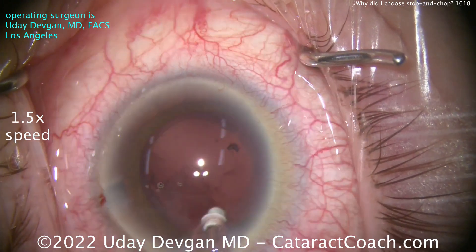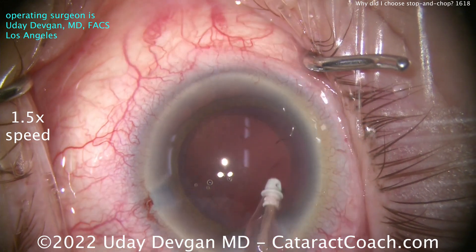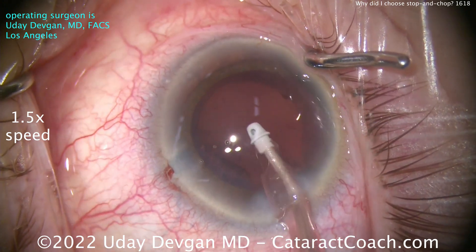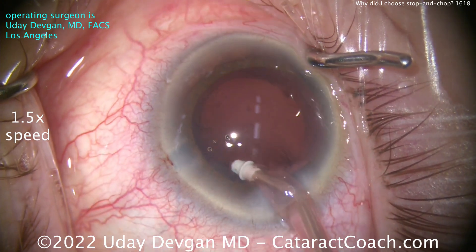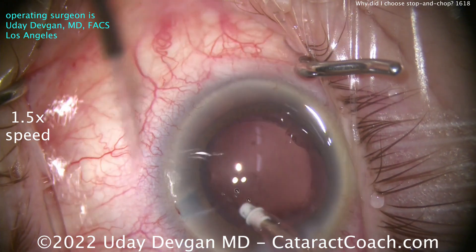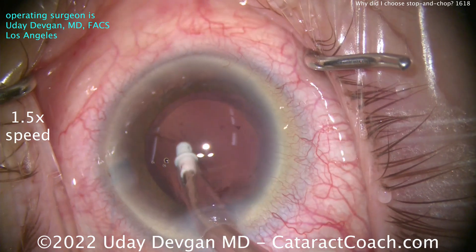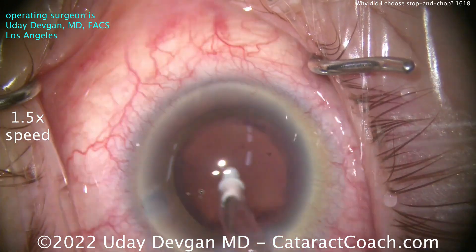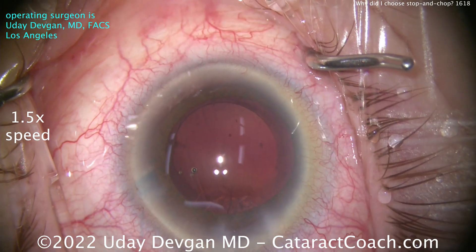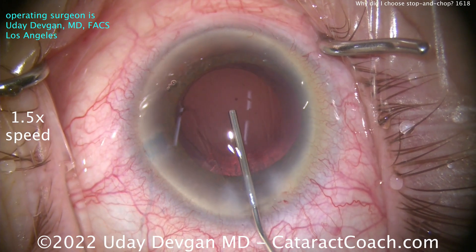I did it, and the patient had a very nice outcome. Now we're going to resolve this patient's issue of narrow angles and the risk of angle closure — we're going to replace that thick, almost five-millimeter crystalline lens with a very thin IOL. That's going to open the angle of the eye wide up, resolve the anatomic issue of the narrow angle, and essentially eliminate that risk of angle closure in the future.